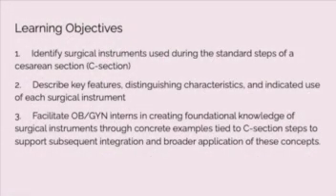In this video, we aim to: 1. Identify surgical instruments used during the standard steps of a cesarean section. 2. Describe key features, distinguishing characteristics, and indicated use of each surgical instrument. And 3. Through concrete examples tied to C-section steps, we hope to facilitate OB/GYN interns in creating foundational knowledge of surgical instruments and to support subsequent integration and broader application of these concepts.